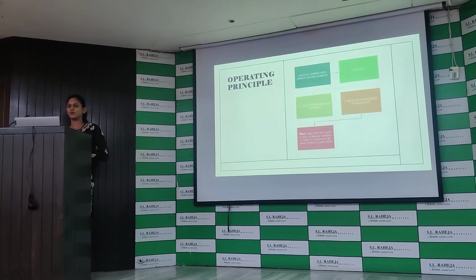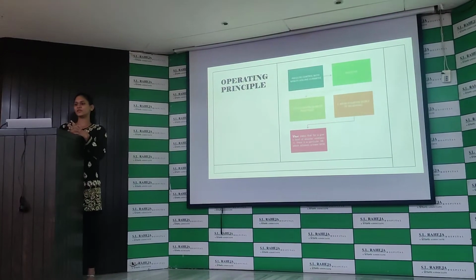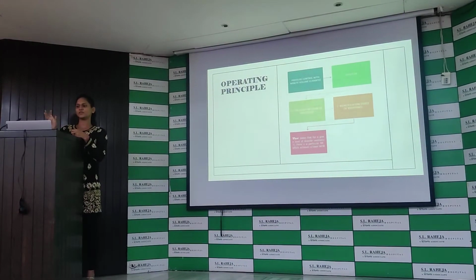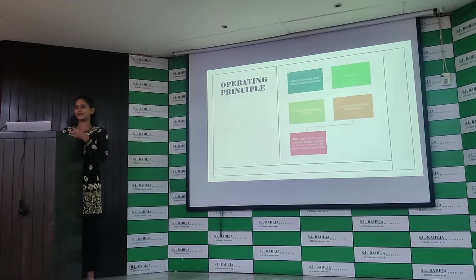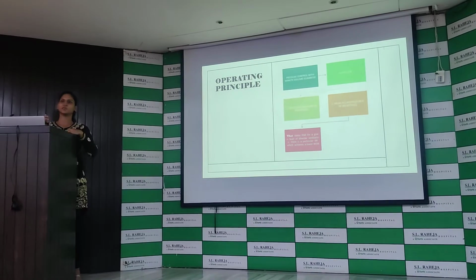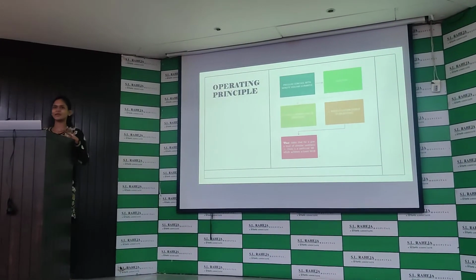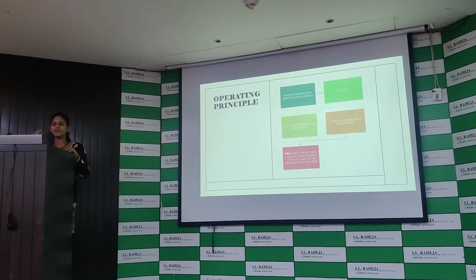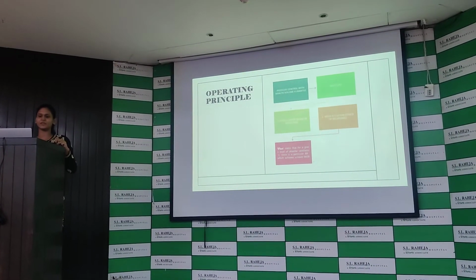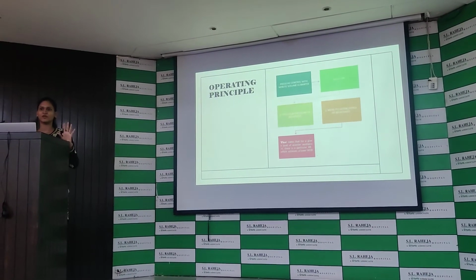So what are the operating principles of this mode? This mode is pressure control with minute volume guarantee. That is based upon two equations: one is the Otis equation and another is the Mead equation. These equations are from 1950. They state that to give a level of alveolar ventilation, there is a particular RR which is required to achieve a lower work of breathing.